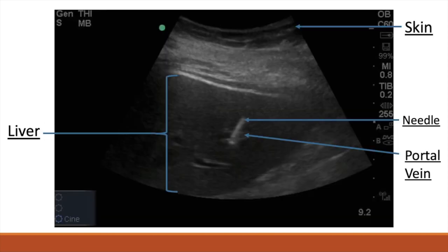The first step of the procedure is to achieve percutaneous transhepatic access of the portal system using an access needle, such as a 21-gauge Chiba, under ultrasound guidance. In this slide, we can see ultrasound imaging of the needle and the needle tip entering the portal vein in the liver body.